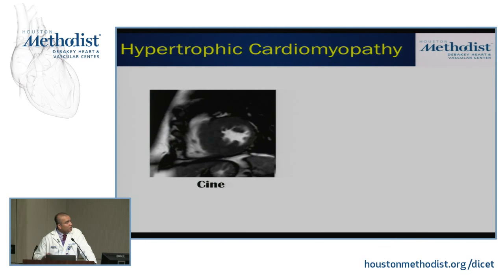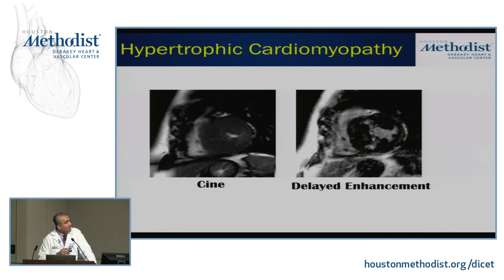Now what about the more garden variety form of hypertrophic cardiomyopathy, which is going to affect the basal segment more than anything else? And what you can see, not only is there hypertrophy, but in fact there's evidence of fibrosis manifested by hyperenhancement here. But what's unusual about this is that it's in a location in the middle of the myocardium at the RV junction sites, at the anteroseptum and the inferoseptum. And again, this is one of the classic findings that you see with CMR in the setting of hypertrophic cardiomyopathy. And again, this is not a pattern of fibrosis that you would expect from coronary artery disease.